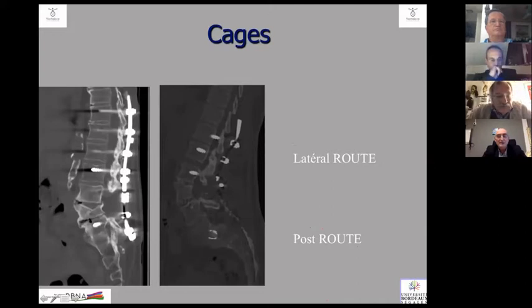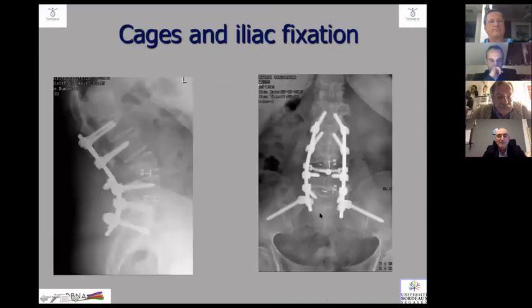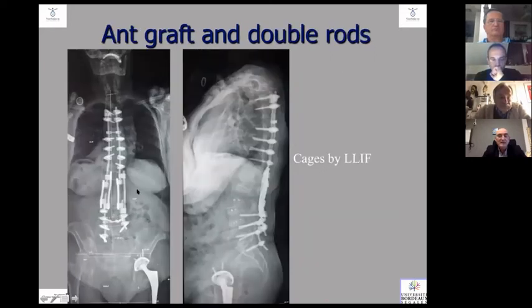And here you can see that when you have a void like this in the front, it's better to do a secondary, in the second step, lateral fusion here, just to avoid to have pseudarthrosis. You can do the Zileli technique during the same procedure with the 2 cages inserted here in the same procedure, or do the lateral fusion in a second step that you can perform before or after the osteotomy. That depends on the case, of course.